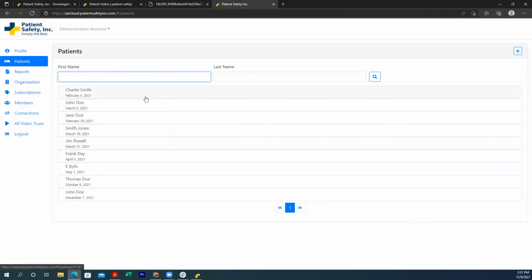And just so that you know as well, Jessica, we are coming out with a beta version of the Connection Center relatively soon that will have a quick lookup feature for patients. That beta download will be available, I would expect, within the next month. So that should, I believe, make it easier to look up an existing patient in the system for downloading new studies.